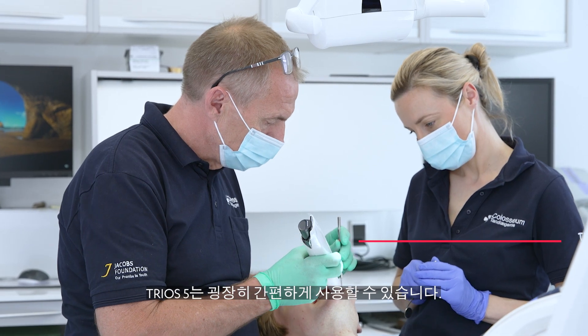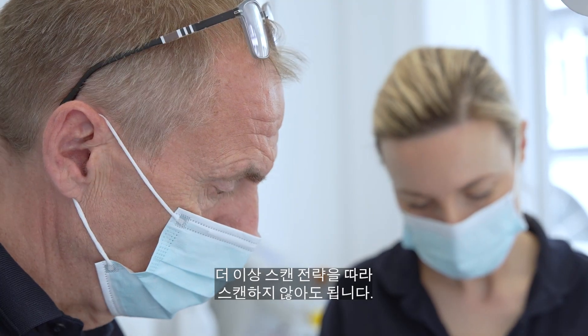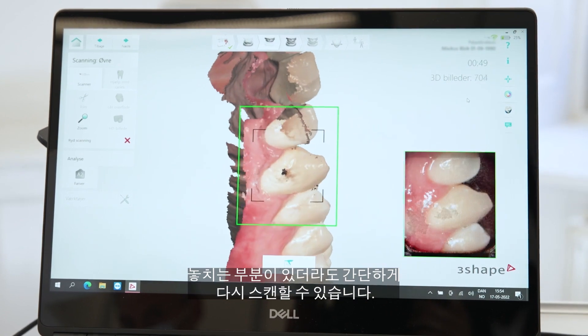I think the Trios 5 is very easy to use. It's very easy to scan with, and the good thing is that we don't need to follow a special path anymore. If I miss some technicalities, I can easily go back and catch it.